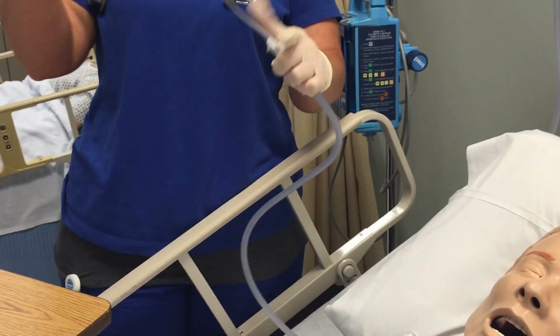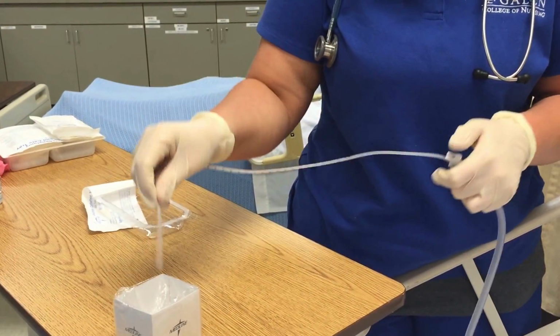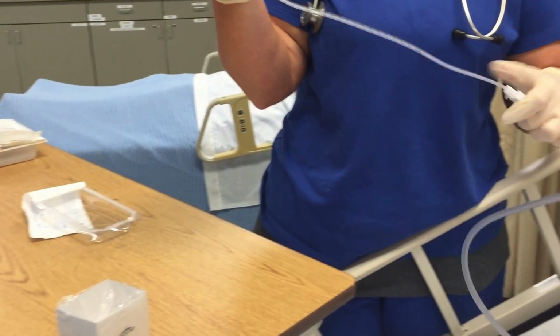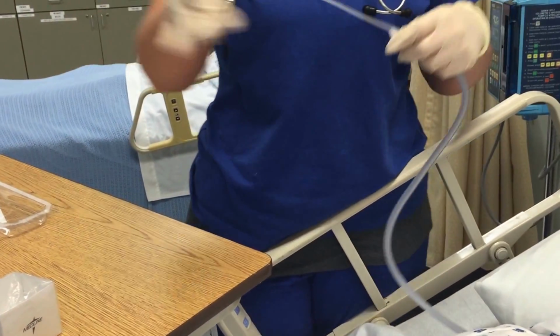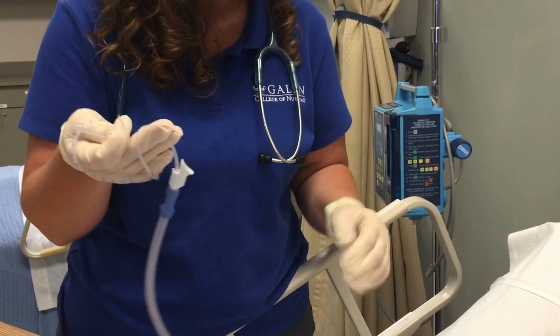I'm going to just check my suctioning, make sure it is working. So I'm going to stick it down in my box and make sure it works. Yep, good, working good. Okay, wind back around here. This way it keeps it from actually falling or dropping on something.